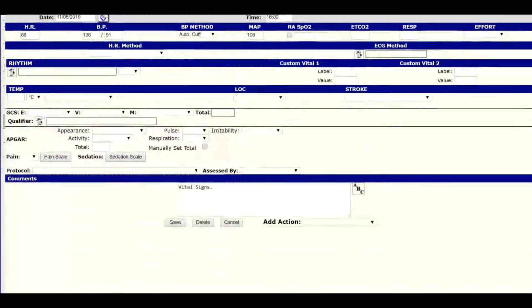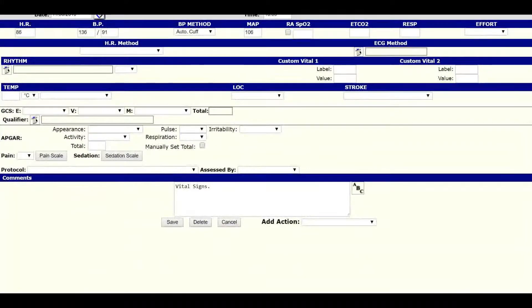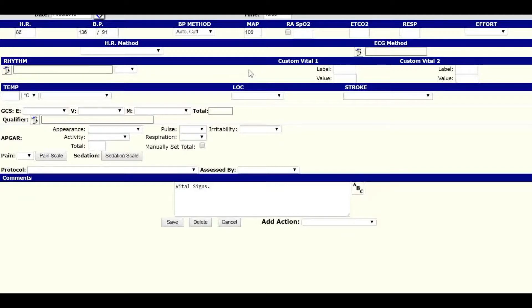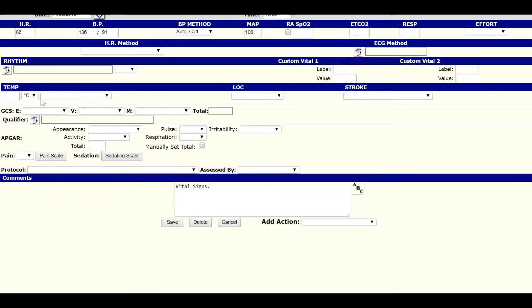Please note that you'll still have to do the qualitative stuff by yourself. The numbers will be there, but you'll have to select the heart rate method, the EKG interpretation method, and the rhythm, as well as any other vitals that, of course, won't be seen through the monitor.